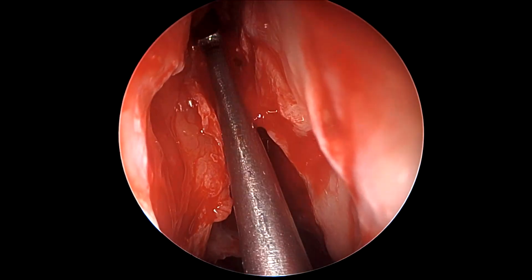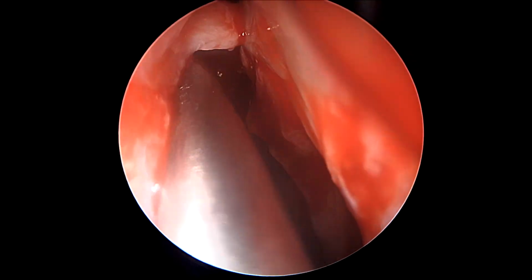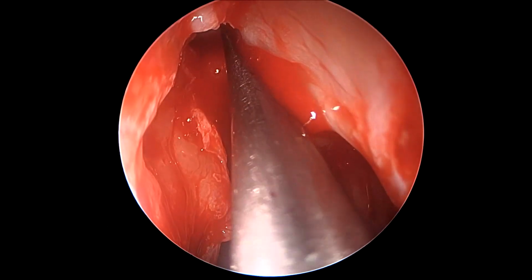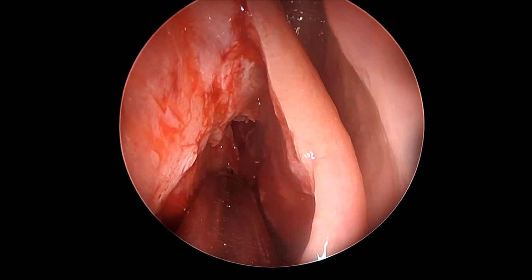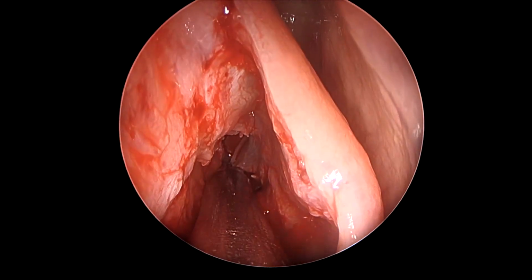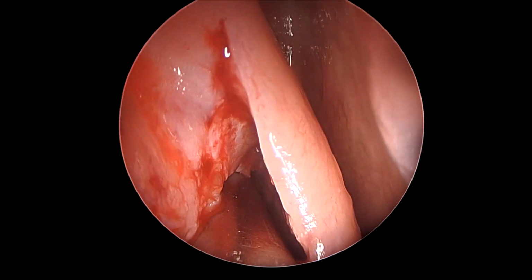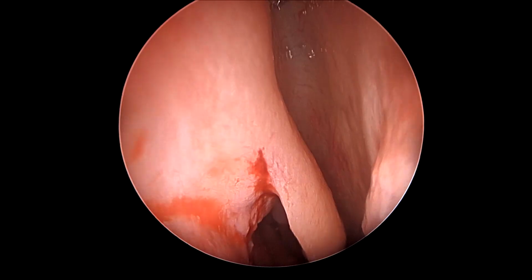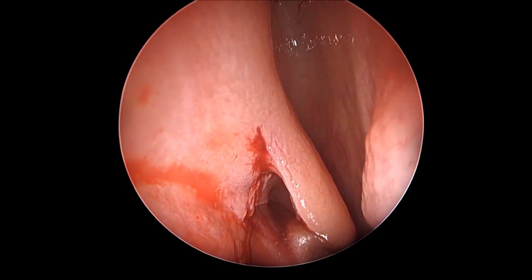Once we have cleared some amount of ethmoidal septations, we again work our way from posterior to anterior inside the frontal recess and the frontal sinus region to remove all the septations and all bone, and the type 2 or type 3 cell configuration that we had seen in the preoperative CT. Once all the bone and the mucosa has been made loose, then one can use a 40-degree angled shaver blade to clear some excess mucosa and tissue from this region. Once again, making sure that the shaver blade does not penetrate the orbit.